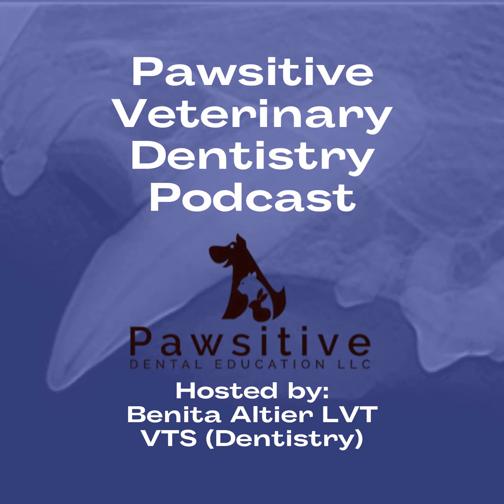Yeah, I think that's such good advice. In fact, that was one of the questions I had for you. We don't want veterinarians to not trust what they see, but they also need to be curious and understand that this is just a two-dimensional image of a three-dimensional object. How can we do more images to gain trust in what we see, looking at that potential pathology being repeated over multiple images? And if it's not, what should our next moves be?